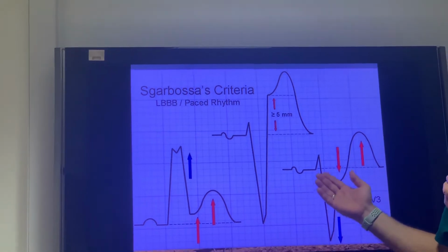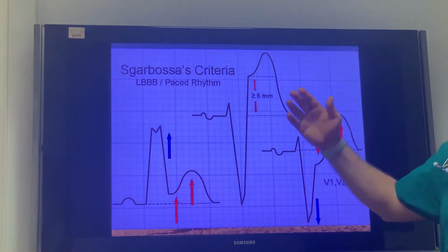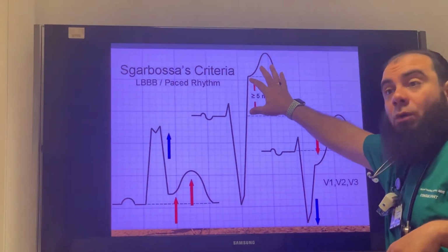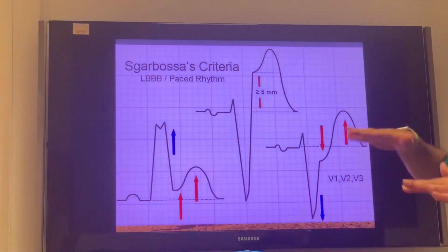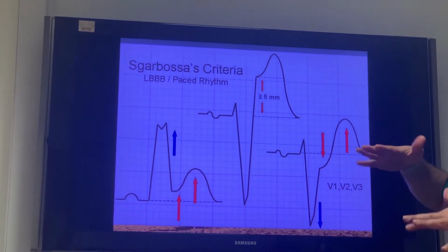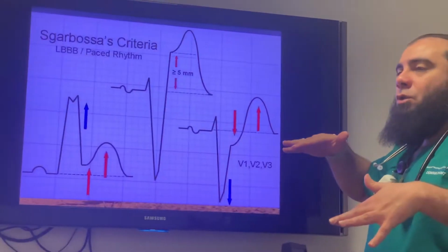And on the other hand, if the voltage is high because of ventricular hypertrophy, because of whatever, so I expect it will be larger and the elevation will be larger, isn't it? So there is some subjective judgment or some clues can actually confuse us, isn't it? You got the point.